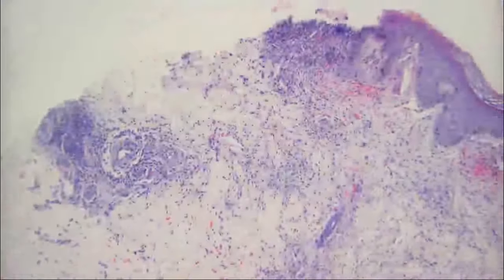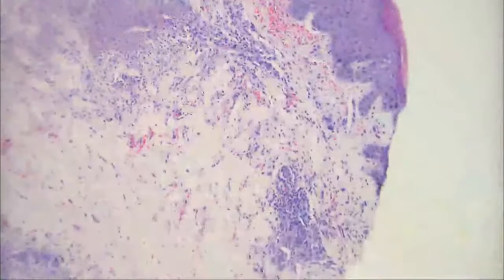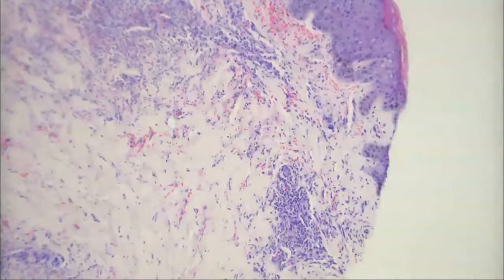That's relatively uncommon for DH. Yeah. So it's kind of a little bit of a confusing picture, but this was dermatitis herpetiformis in this case. Obviously, there's a long differential diagnosis of other things that could be neutrophils. So we've got a picture of that here. This is what DH looks like.